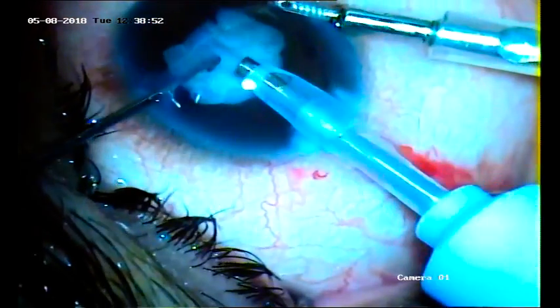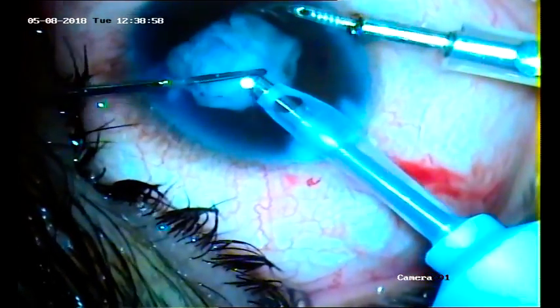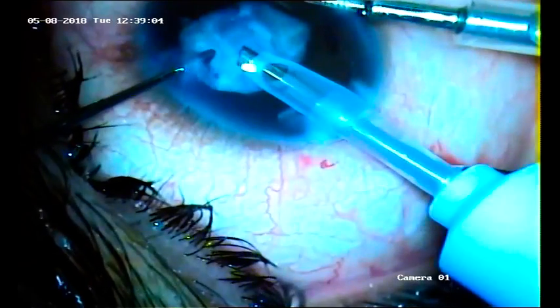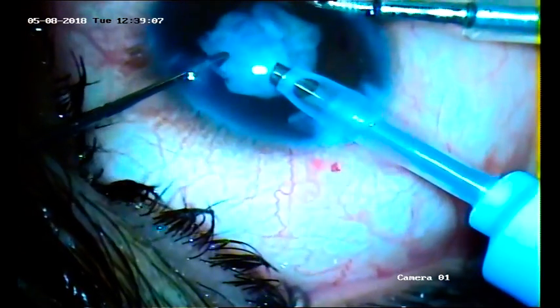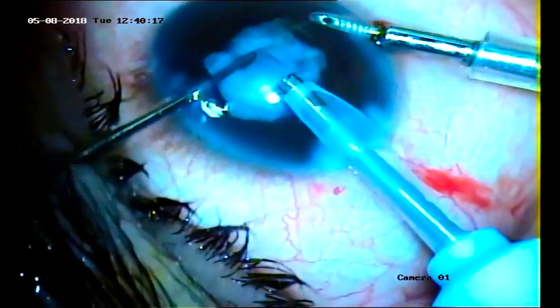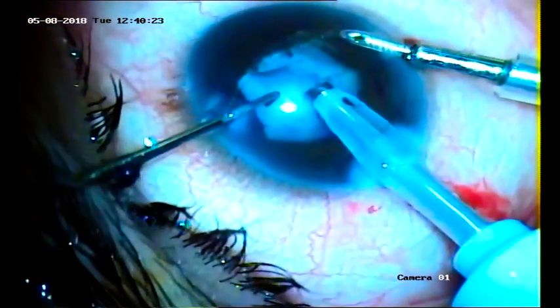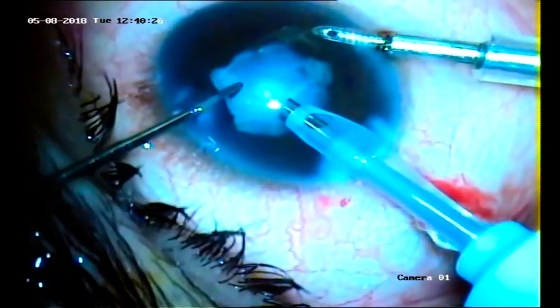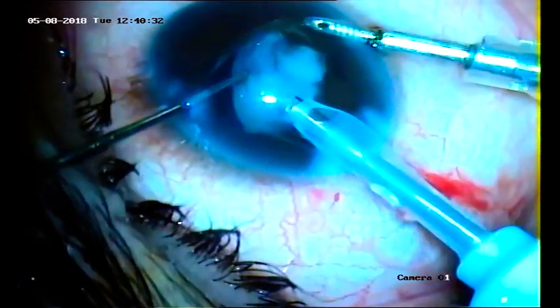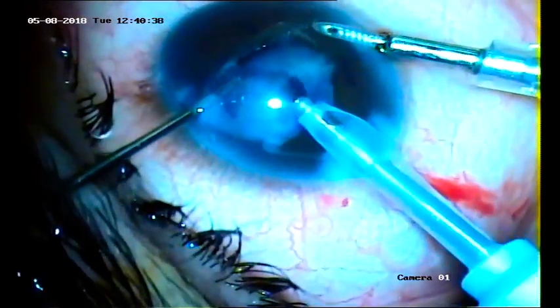In the nucleus management, phaco power was used minimally and the nucleus was slowly removed. As the patient is a young individual, the cataract is a soft cataract. But in this type of cataract we cannot predict — at places it can be calcified, firm, with adhesions — all of these things we have to take care of.